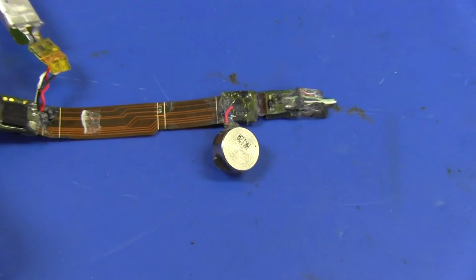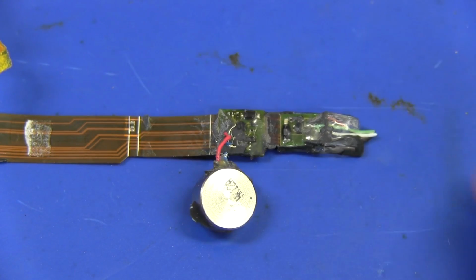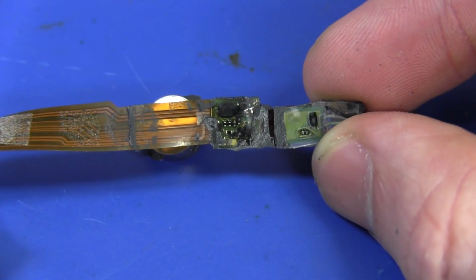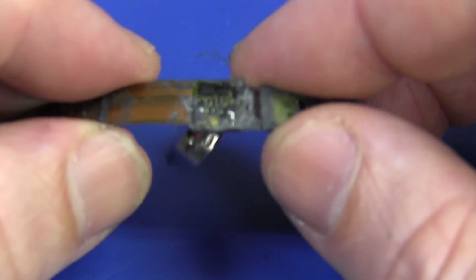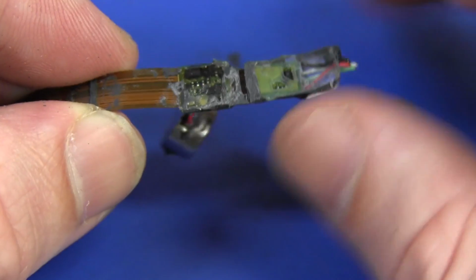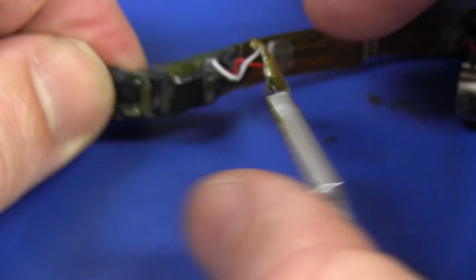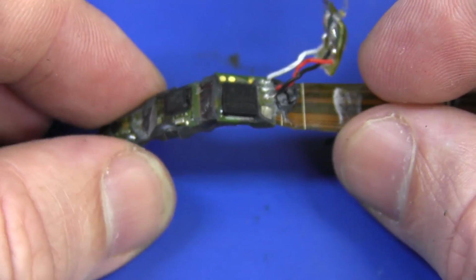Coming in on this side, we have the interface board. They're the wires coming in for the user 4-pin TRS jack. Then we've got our piezo ceramic accelerometer. There it's got its own little board. Once again, double-sided load on both of those. And that rigid board, hence why it's called a rigid flex, is just sandwiched, as we said before, between the flex material down in there. And that's how you join all the boards together, because you don't. That does the physical interconnection between the boards. So you don't actually need a connector as such. It's all manufactured and sandwiched in as part of the board.